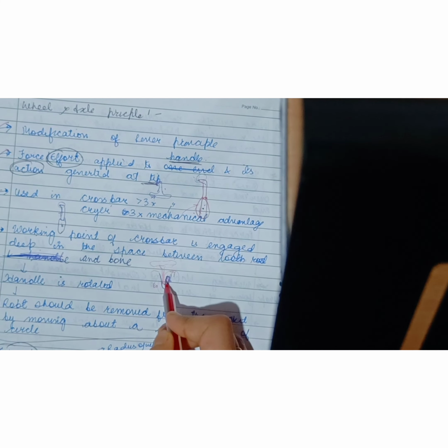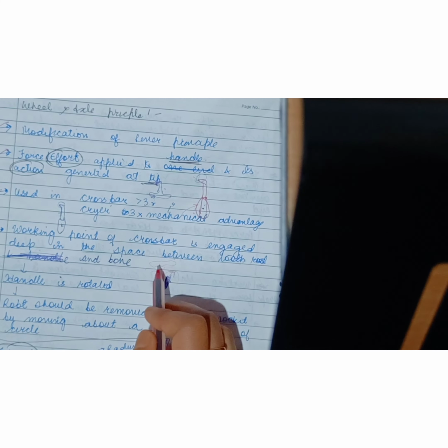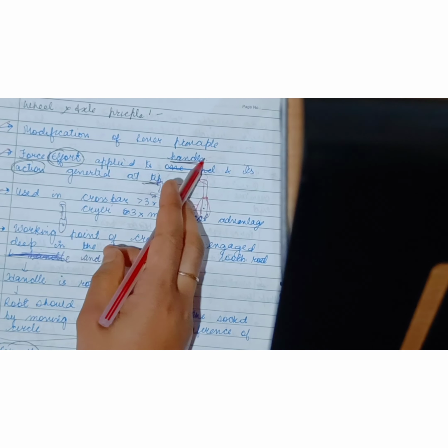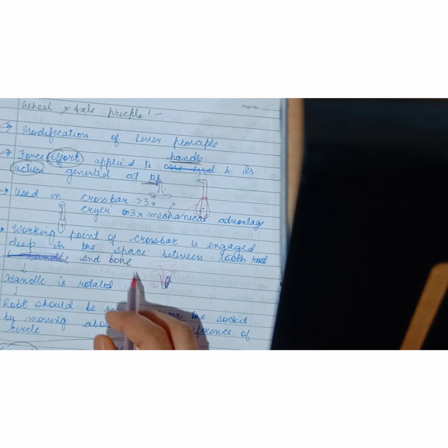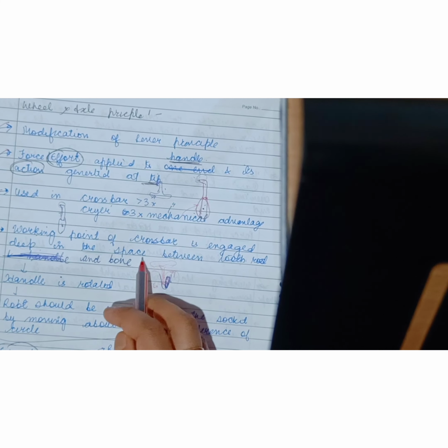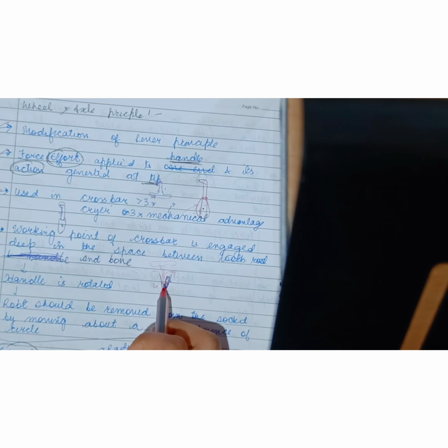So the working point of the crossbar is engaged deep in the space between the tooth root and the bone. This is the root which is still in place, and this is the bone. We will engage the working point of the crossbar, and then we will rotate the handle and the root will be removed, because the force is applied to the handle and its action is generated at the tip. Since we have engaged the tip in the space between the tooth root and the bone, and then we have rotated the handle, the action will be generated at the tip and the root will be removed.